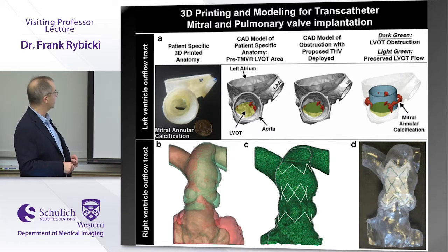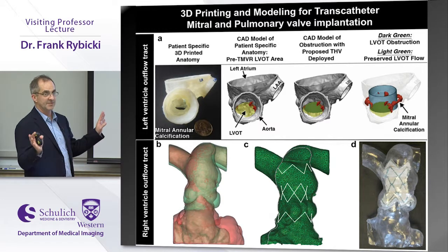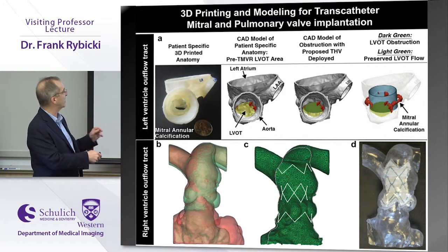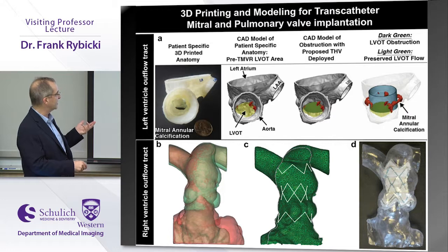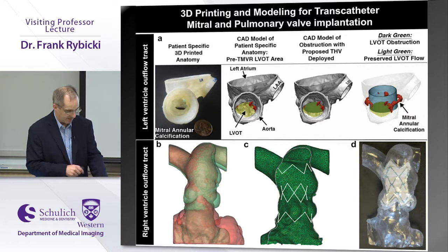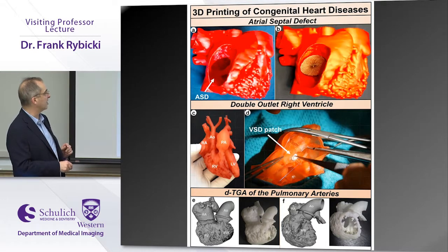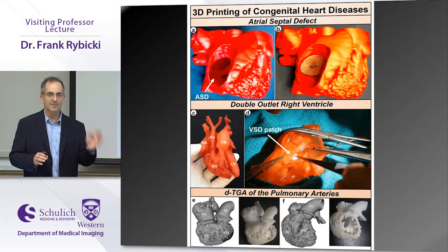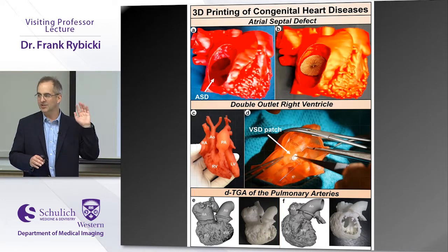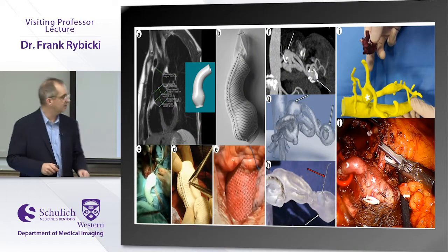These are implantation. These are all different publications in the field. I'm taking things from the literature now. Everything I showed you before was our own stuff, but now I'm taking literature stuff. Some of these are our own cases that are in the literature, but you can actually 3D print something. You can deploy the stent, 3D print the stents. This is a patient with an LVOT. I talked about the congenital stuff, and all congenital cases are 3D printed, hands down. If you have a simple ASD, VSD, PDA, you don't need to 3D print it. You can go in and correct it with a good MR. Anything else needs to be 3D printed, unquestionably.